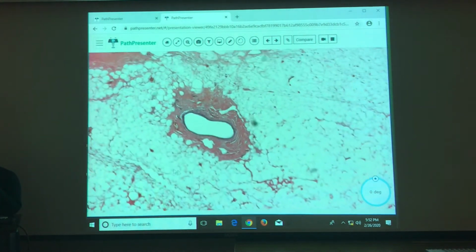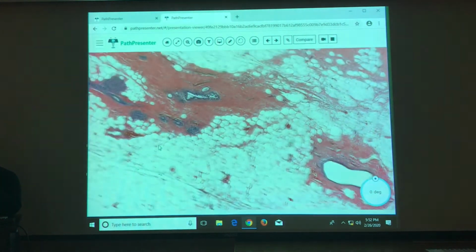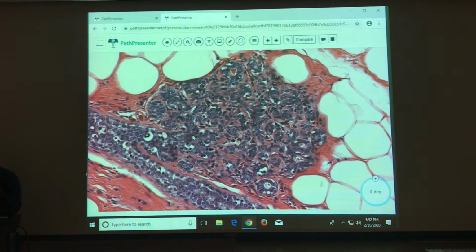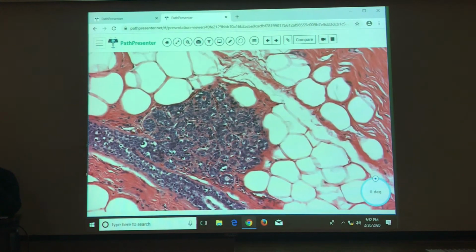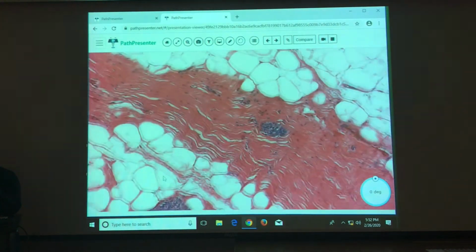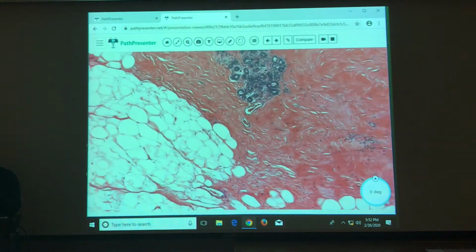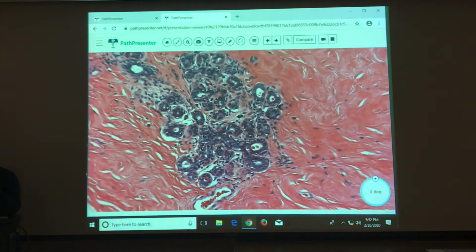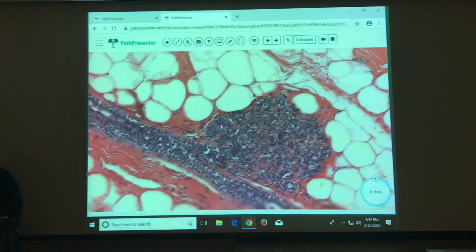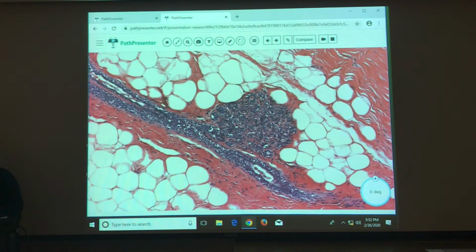That one is a little dilated, but over here, whoa, what do we see here? This doesn't look normal, does it? Not quite, compared to the normals that we would see in this one, for instance. Those look a little more disorganized, a little more crowded.